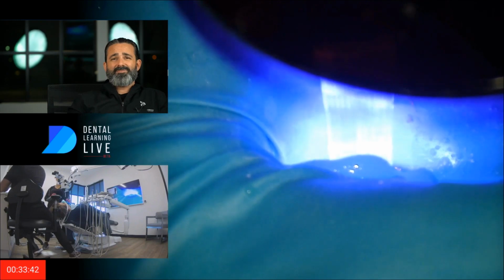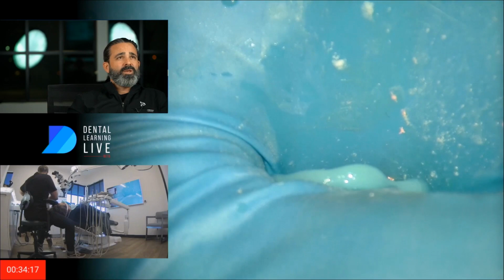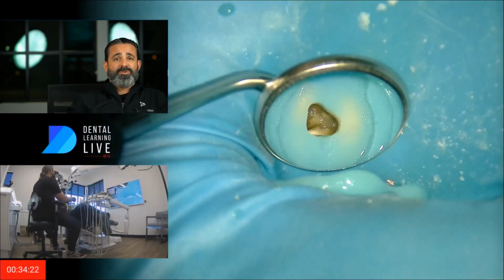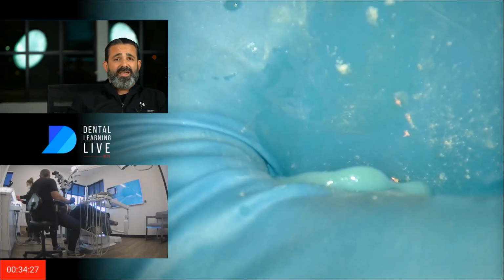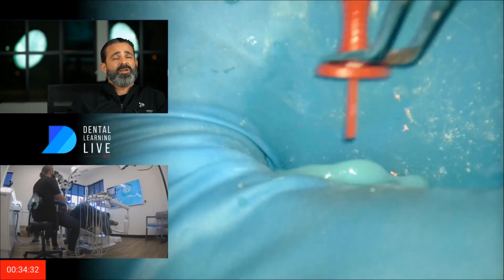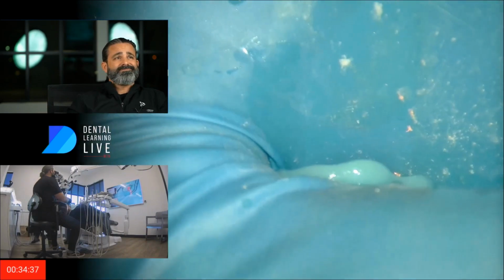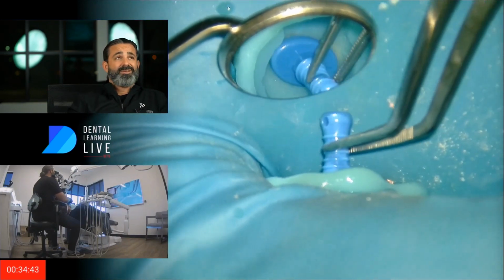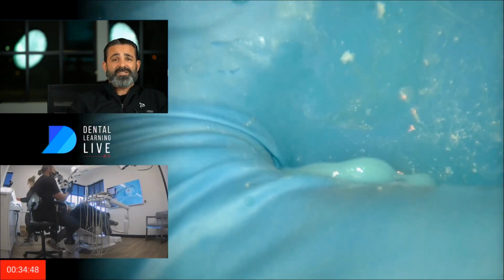So I've stopped sweating the stuff that I don't need to worry so much about, and being so picky, which I did start out that way, by the way. I always wanted that goal to build the platform right the first time, and I may have even done a video saying that. Because I say that to myself all the time when I do my endo, and I was saying that to myself when I'm doing my sound seal. But now, when I realize the forgivingness of just reapplying this conforming resin of Sound Seal, man, it's just so much better not to sweat it, build it, and if it's there, fix it, because it's a 2-second fix. It's a lot easier.